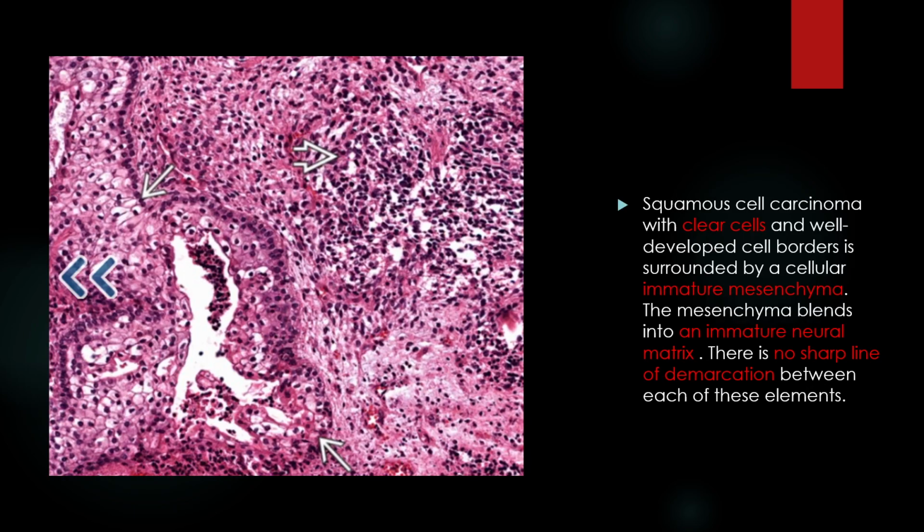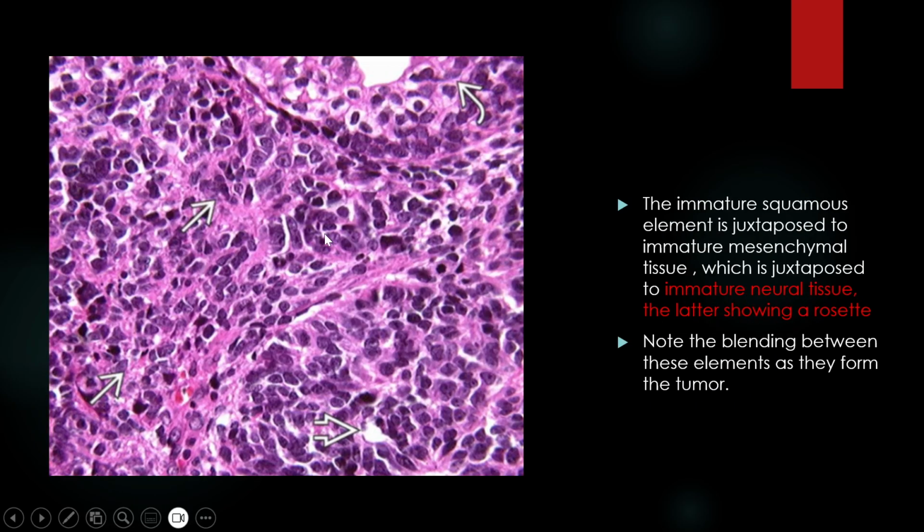Because in immature teratoma, we always need to look for this immature neuroepithelial component. Another one also shows this immature neuroepithelial forming this rosette. So whenever something forms this rosette, we need to think about immature neuroepithelium. If there is no other component, we need to think about whether this is a small round blue cell differentiation, including all kinds of blastoma: neuroblastoma, medulloblastoma, retinoblastoma.